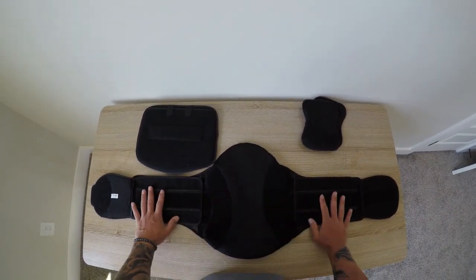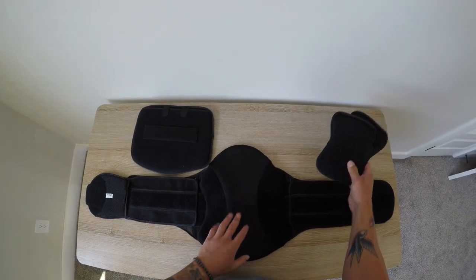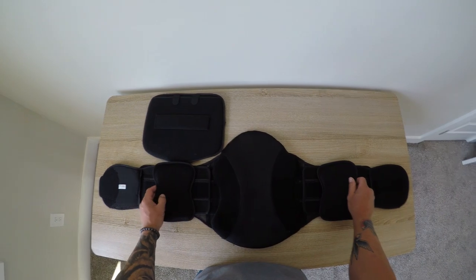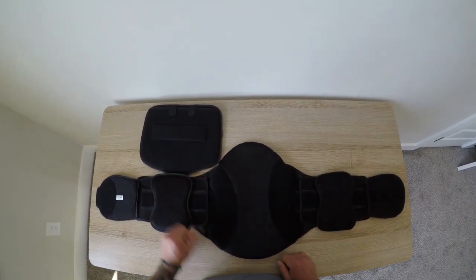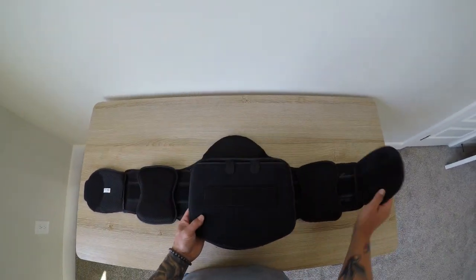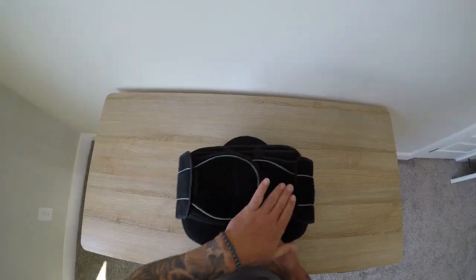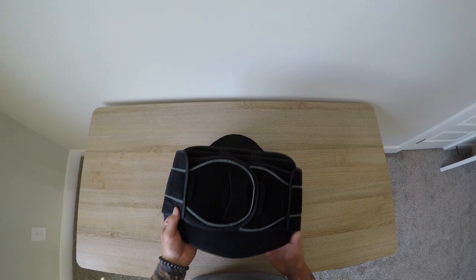Once fit — whether it be L0631, L0648, L0637, L0650, or L0639, L0651 — the patient has ease of use sizing and fitting this brace.